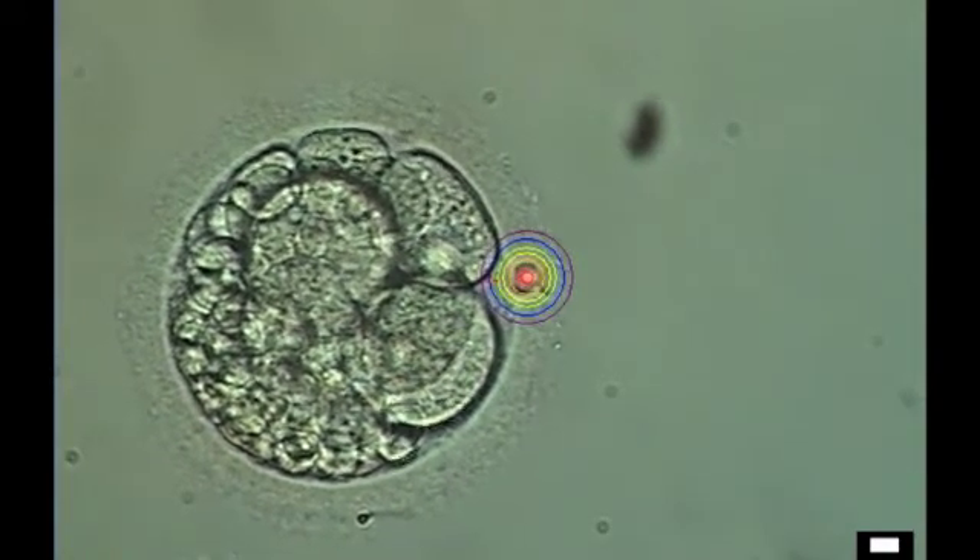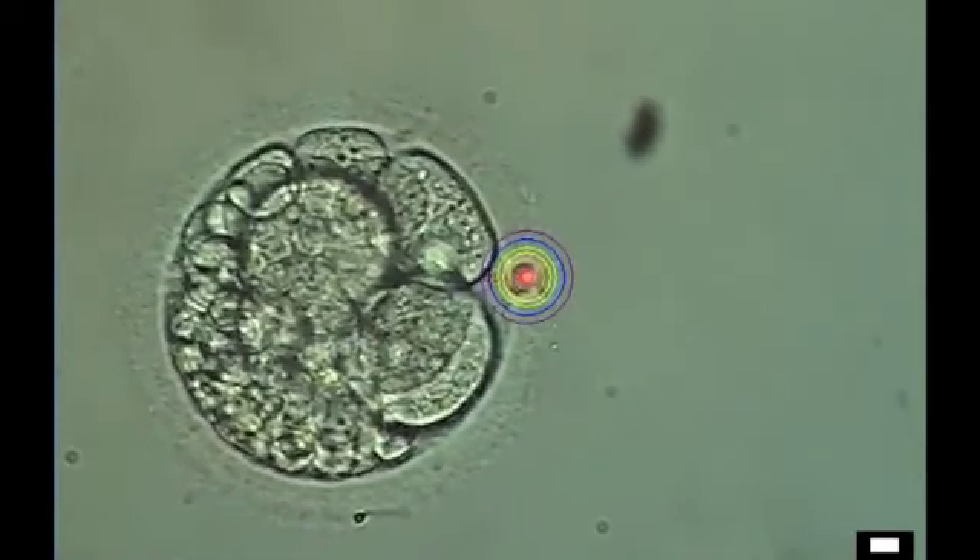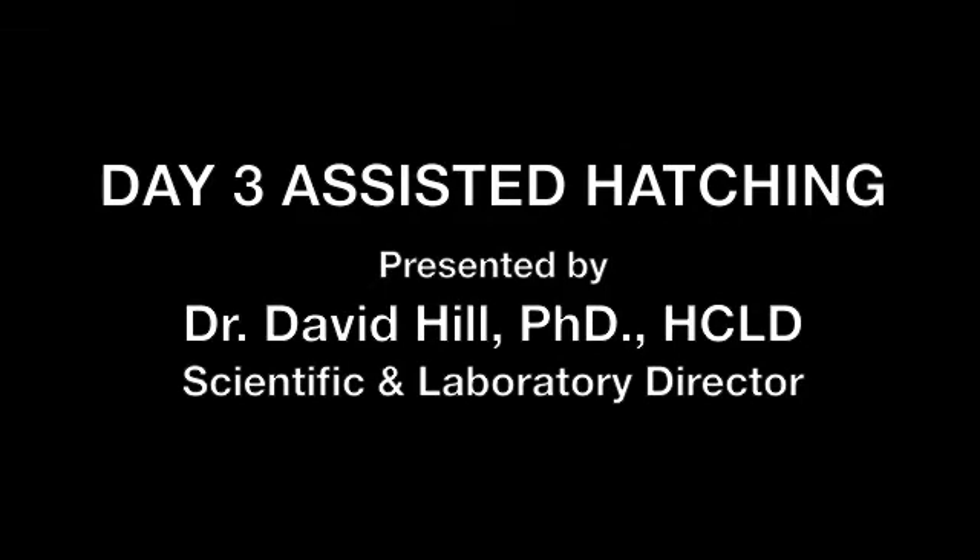We also use the laser for doing a technique called pre-implantation genetic diagnosis, where the embryo has to be biopsied. Using the laser to create an opening, the operator can then go in and biopsy or remove a cell from the embryo, and we can have it then evaluated.